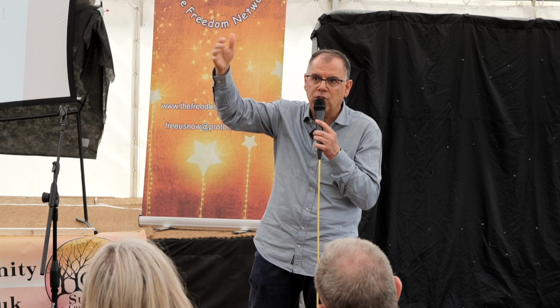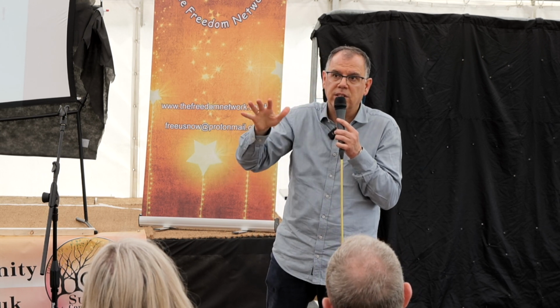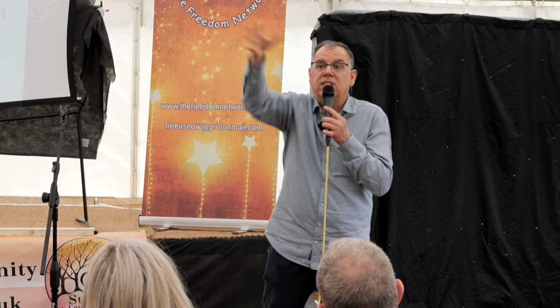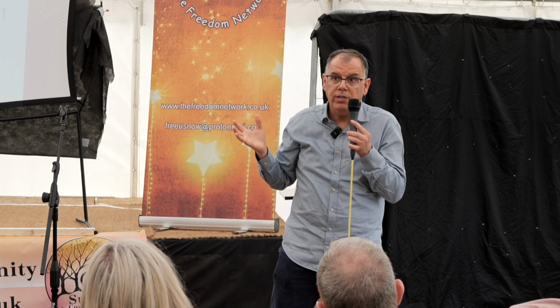It will heal around a ceramic material. It's not titanium. I have inserted thousands of titanium implants, but I have inserted 50, 60 ceramic or ceramic coated implants. It's a big difference. So we don't have a huge literature about ceramic implants as we have for titanium implants. But that doesn't matter. It does work. Among those 50, there will be a failure of one or two, as with titanium implants, where there is a failure of 3 to 10% worldwide.